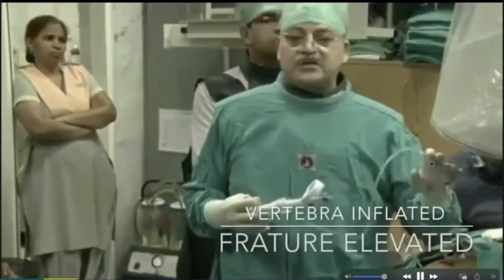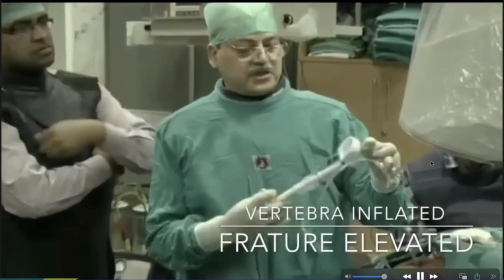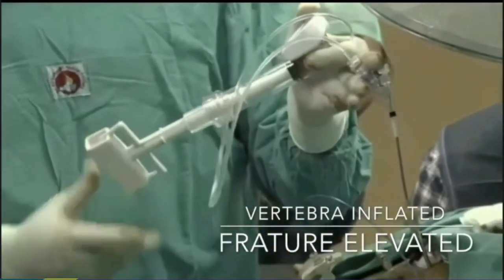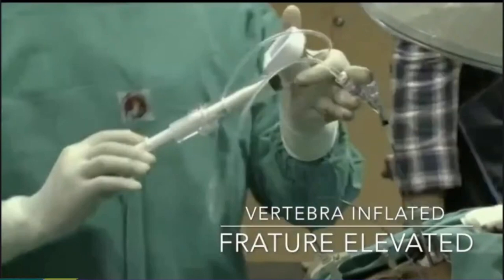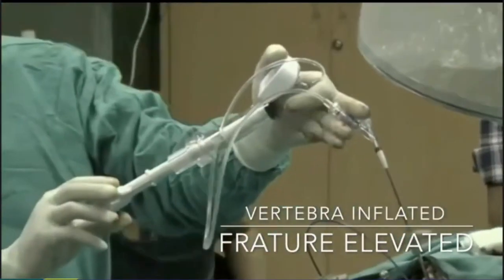Keep the balloon in place where it wants to be, mid body or the front, depending on how the fracture is, and you start increasing pressure; up to 700 psi you can go. But mostly in osteoporotic fractures, 100 psi is more than enough for inflation. But yes, keep it in mind, these balloons are known to rupture. If they meet a bony spike, it might rupture.